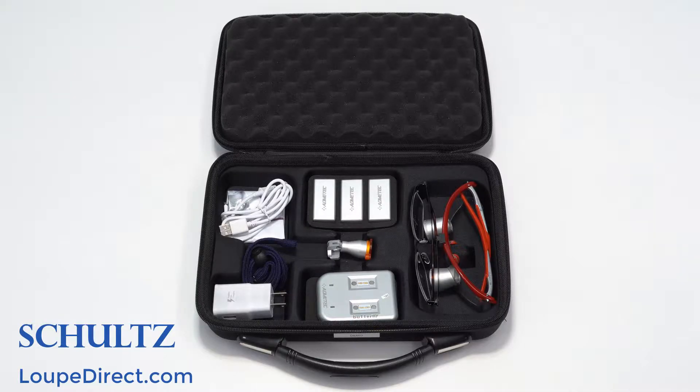In our demo kit, you will find a set of loops in the style you selected, a head strap, and a PD measuring frame, as well as a headlight, batteries, and charger if you chose a combo package.